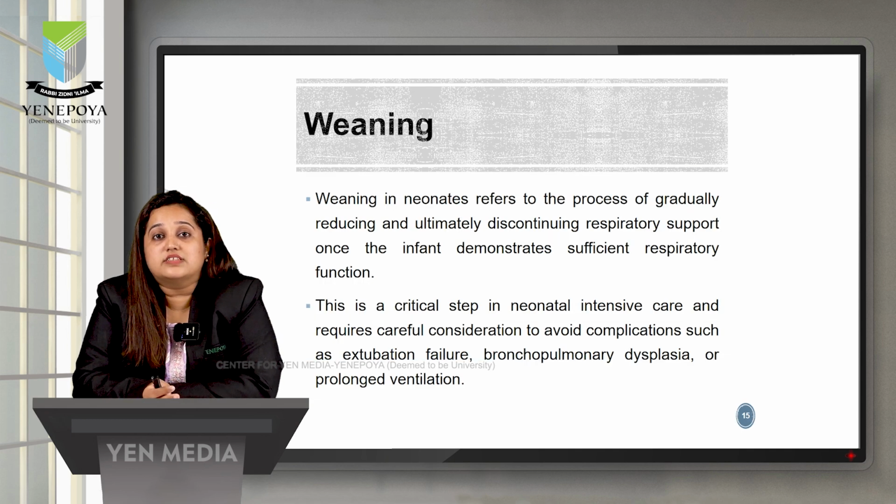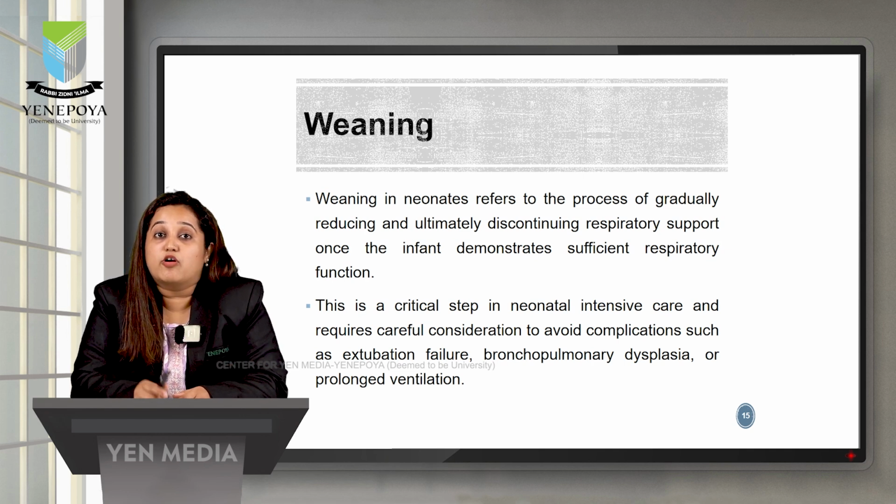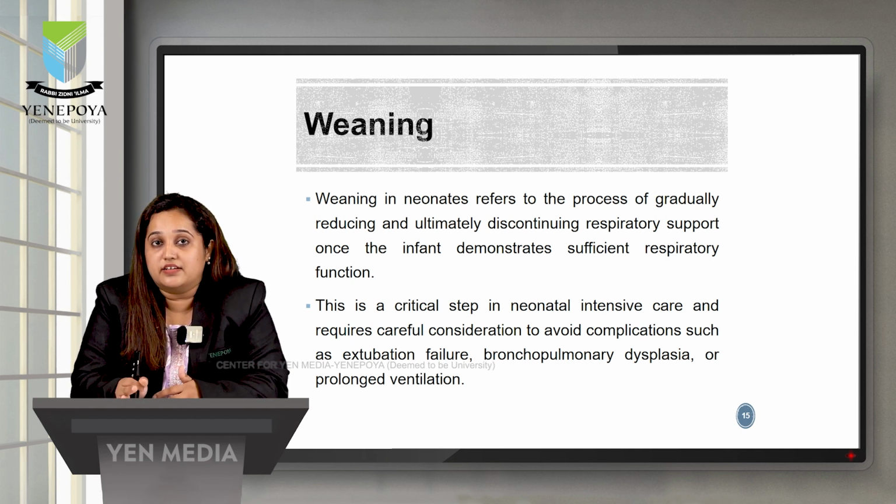Now that we have also seen how to maintain a baby while it is being ventilated, the next step is definitely weaning. So what is weaning? One thing when it comes to neonatal mechanical ventilation is we start thinking about weaning the baby and extubating the baby from the time the baby is intubated, because the babies have a higher tendency to become comfortable with the mechanical ventilator and then ultimately become ventilator dependent.